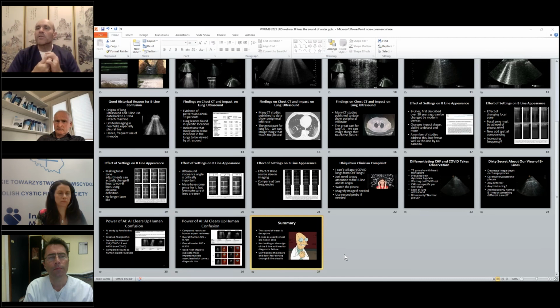The normal lung ultrasound exam is less exciting, less interesting, less varied, and you really depend on the abnormal ones. So I think probably at about 50 abnormal lung ultrasounds, I would start to feel comfortable, but it also depends on what the person is looking for. If they are a trauma surgeon and they only look for pneumothorax, then probably they need much less than 50.